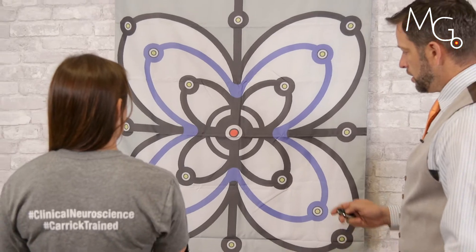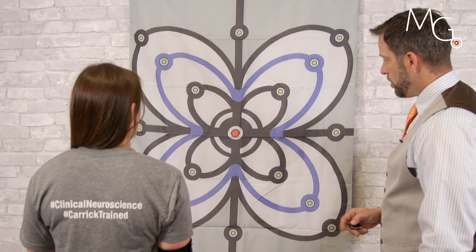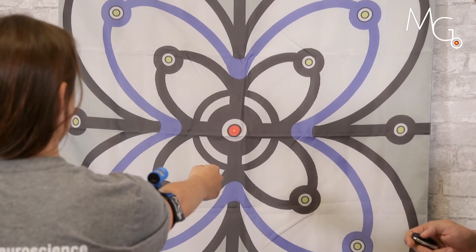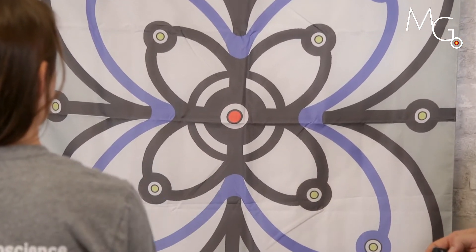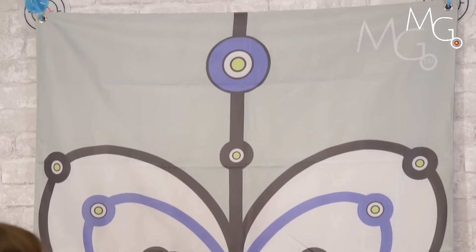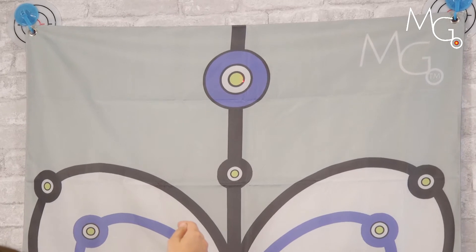Take the feedback away, return to where you think the middle is, and come back down. Try above at approximately 135 degrees, and come back down.